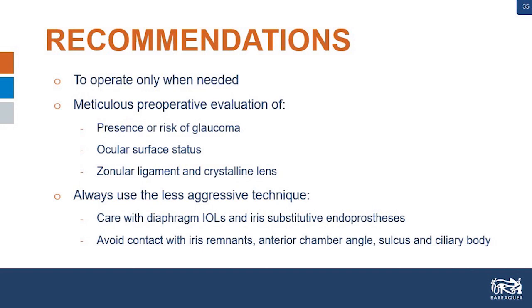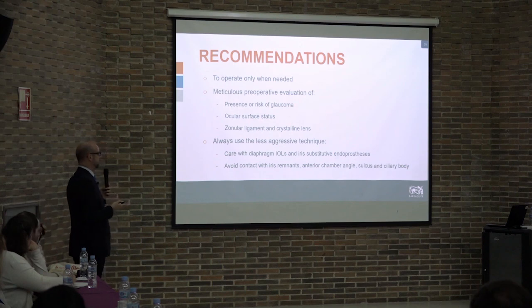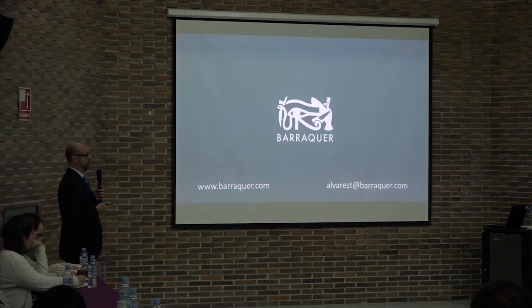Now we have better techniques to fixate lenses if we have problems in the zonula, with less plastic material inside the eye, like the Canabrava technique, because suturing a lens, in my opinion, should not be done in these cases. And always use the least aggressive technique. We have to take care with diaphragm IOLs, only indicate them in very quiet eyes and in older, not young, patients, where this kind of lenses or endoprosthesis can be suitable, and always avoid their contact with iris remnants, anterior chamber angle, sulcus, and ciliary body. Thank you very much for your attention.